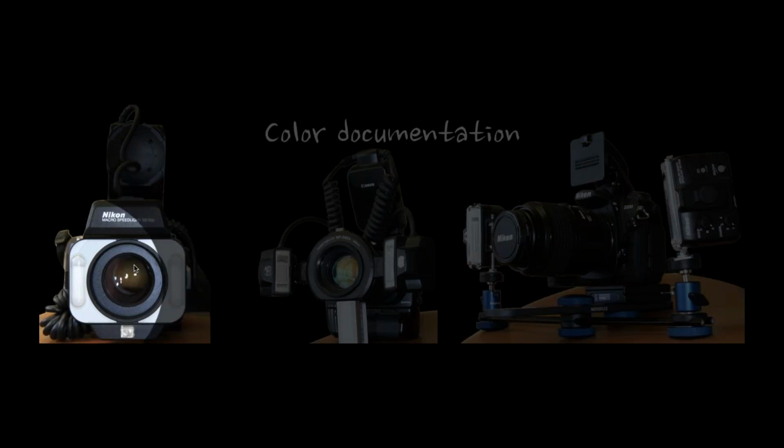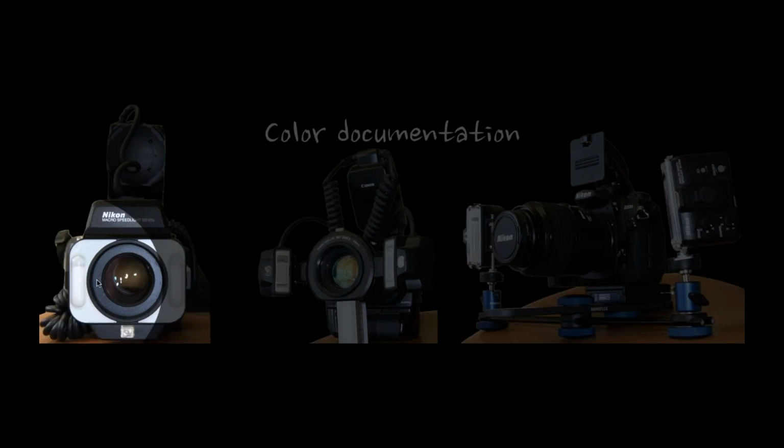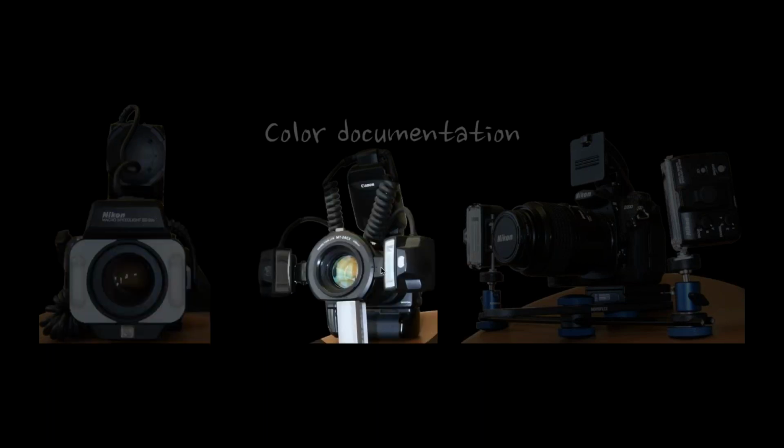So yes, there are 2 lights here, but those 2 lights don't matter. Why? Because of the proximity of the light to the lens. Anytime you attach it to the lens, it is a ring flash. Even these, where I have 2 flashes on the side, look what they're attached to. They're attached to the lens. That makes them a ring flash.